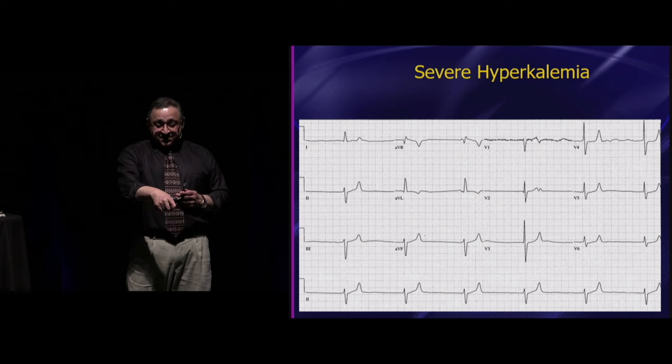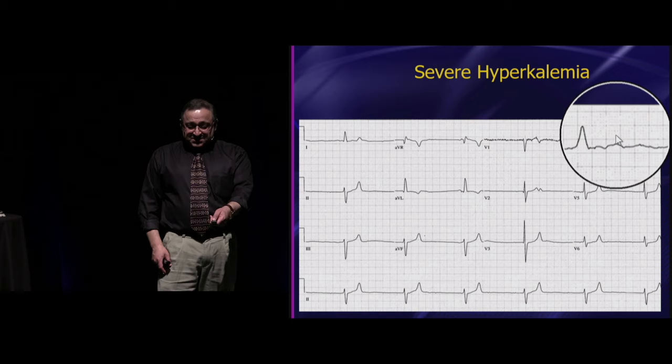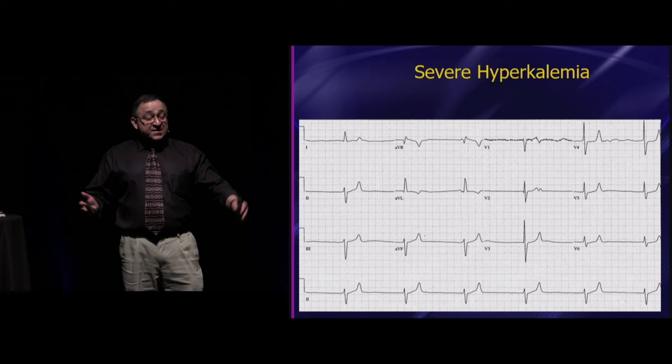So he calls paramedics. Paramedics arrive, and they look at this. Take a look. The QRS is really not that wide. T waves are minimally peaked, just maybe out there you'd notice it. Most people would probably totally miss the peaking of the T waves. The paramedics didn't see the peaked T waves. And so they give the guy some atropine. It doesn't work. Why doesn't atropine work in hyper-K? It's not a vagal condition, right?